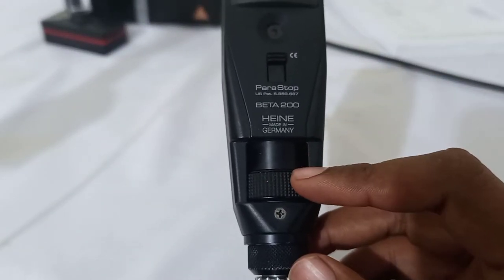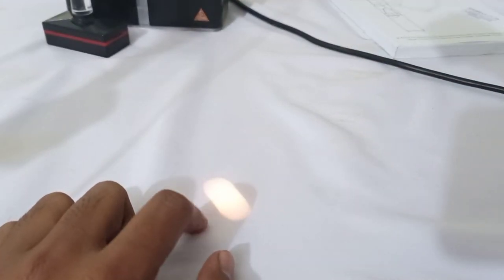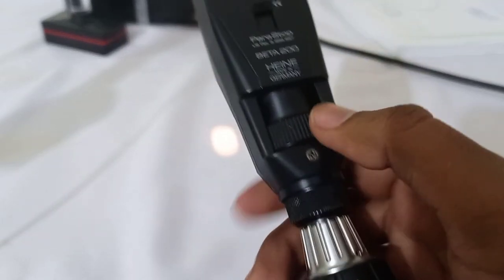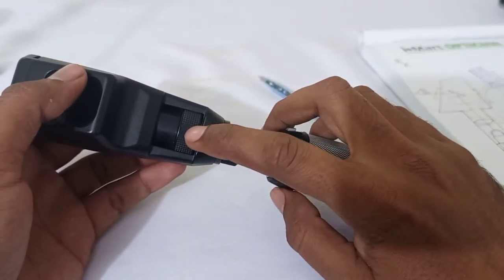After switching the retinoscope on, if the sleeve is down you can see the thickness of the streak is higher — this is the plane mirror effect. When I push the sleeve up, the thickness of the streak gets lower — this is the concave mirror effect. You can perform retinoscopy at plane mirror effect by moving the sleeve down, and at concave mirror effect by pulling the sleeve up.